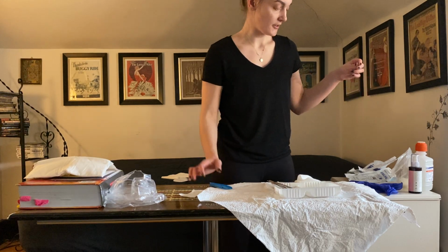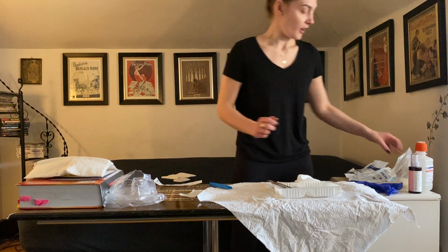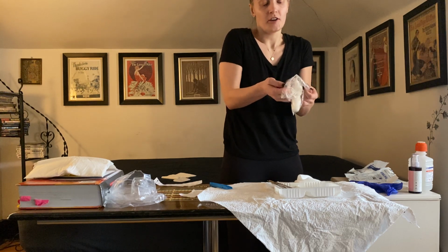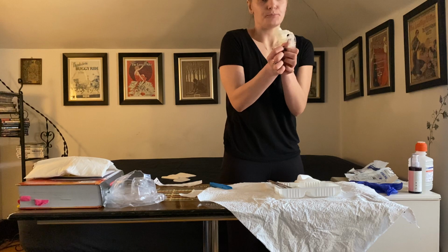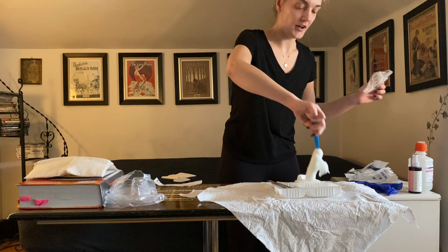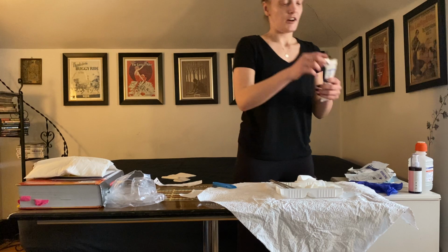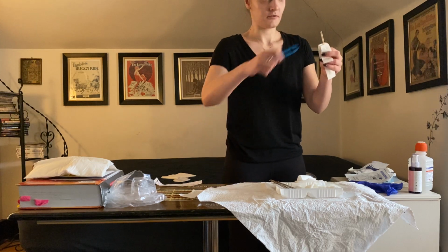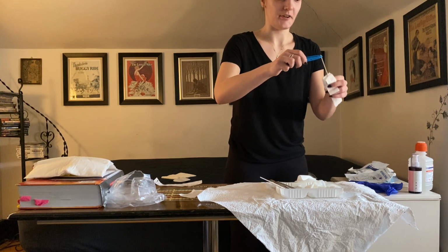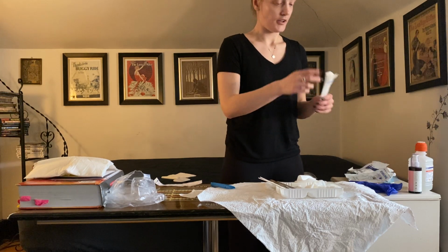So now I'm going to begin adding to my sterile field here. So I'm going to start by putting my little ruler beside. So normally this Curlex would be in a sterile packaging. I'm going to try and demonstrate just with the Ziploc, but you'd wing the sterile packaging back. Again, this would normally not be opened already, but I'm going to add that. Adding my cotton tip applicators. And again, this table would be at waist height normally, but I'm working at home.